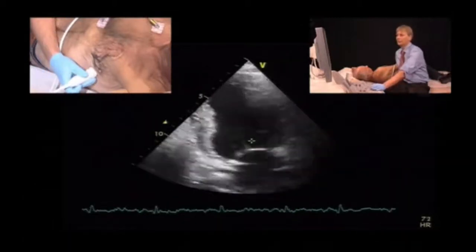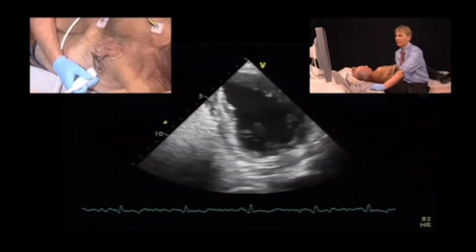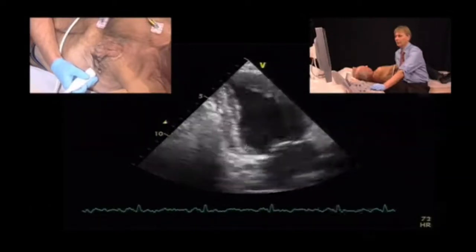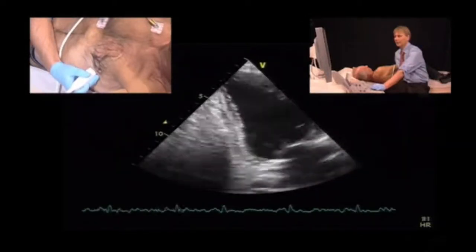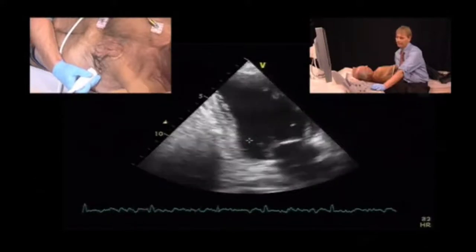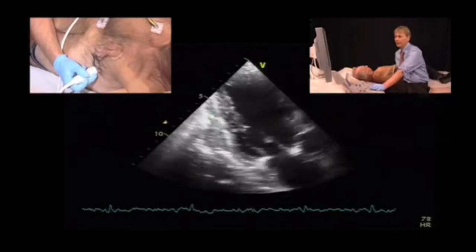Let's go to the two-chamber view, and here you will immediately appreciate that there is akinesis here. Wall thickness seems to be present here in at least portions of the inferior wall, and dense echogenicity here. I'll just tilt the transducer to all the different regions of the inferior wall. You see the scar goes all the way up to the mid portion of the inferior wall. And then I will turn the transducer more towards the posterolateral region. And again, you can see there's a scar here.